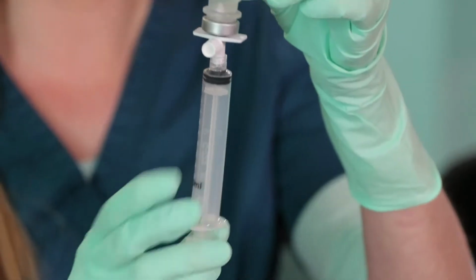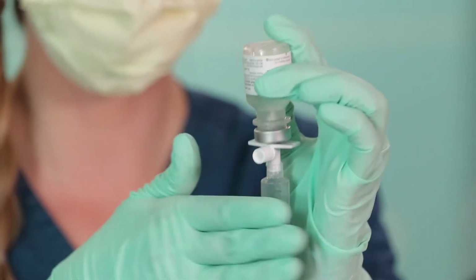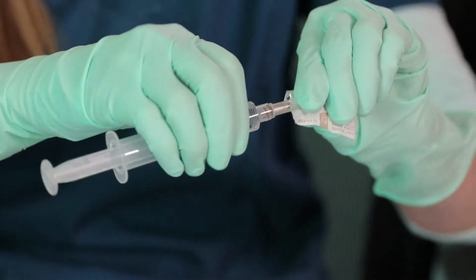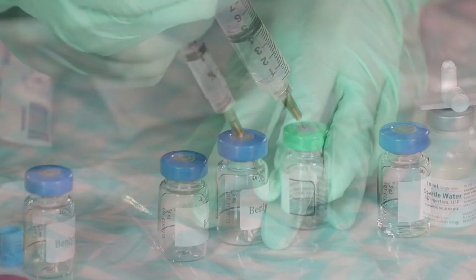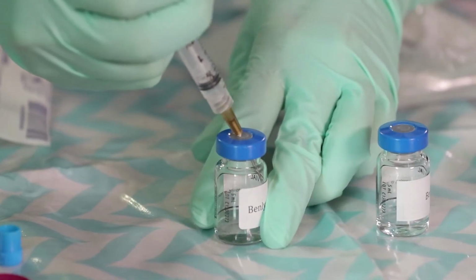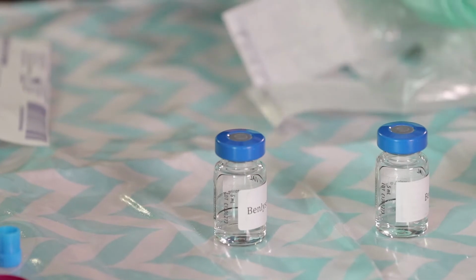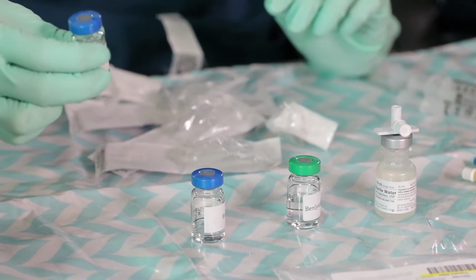Reference the specific drug mixing instructions to select the correct syringe size and draw up diluent in order to reconstitute the drug vial. Reconstitute the vial following drug-specific instructions. A best practice is to run the diluent slowly down the side of the vial. Gently mix the medication vials to ensure even distribution of diluent.